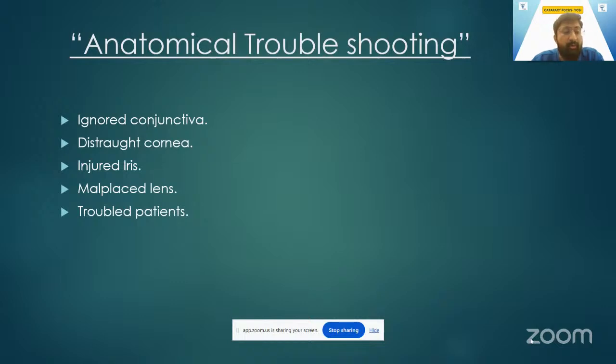The second thing we talk about is a distraught cornea. Whenever bad incisions are there, it causes a lot of wound burns. Because of frequent movement, that area of the cornea ends up getting hydrated, and eventually that induces a domino effect, right from difficult steps, to being careful every time you insert your phaco probe, to trying to do visco, and eventually having fearful complications like Descemet's detachment. This is what happens at the cornea level when you have a bad incision.